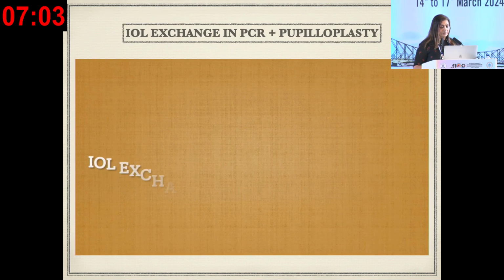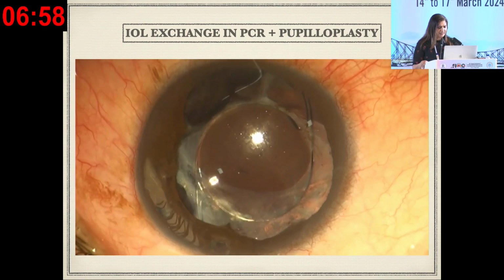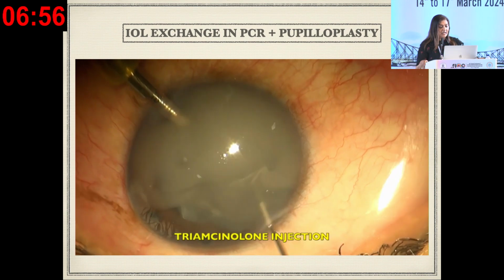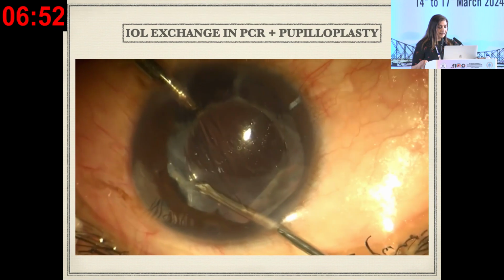Okay, now going on to this clinical case, this is a case which I did, I think, last month. This is a case which was operated by the referring surgeon, and everything seemed quite good.